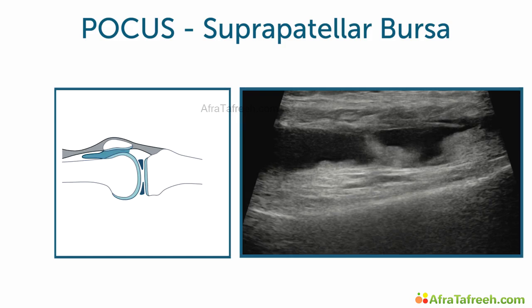Here again is a longitudinal image of the suprapatellar bursa fluid, this time with the leg extended. So you can see here in the diagram the leg is fully extended. Here is the fluid still apparent on the right of the screen. Sometimes if there's not much fluid present, with the leg extended, you may not see any fluid at all. So it's important just to have a look in this plane.